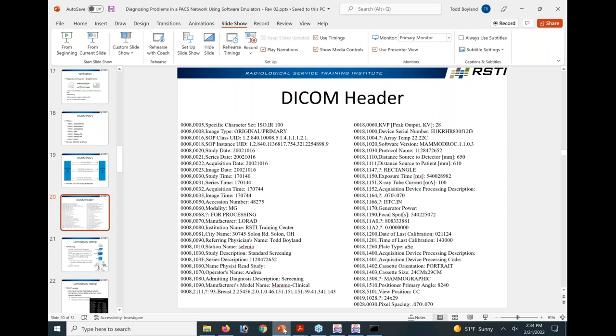So basically just draw a circle right in here with all the zero tags right here. And make a note that says command to store image. Command to store image.